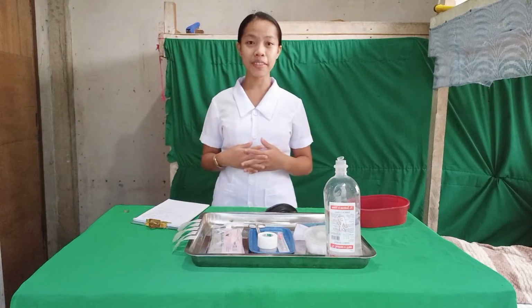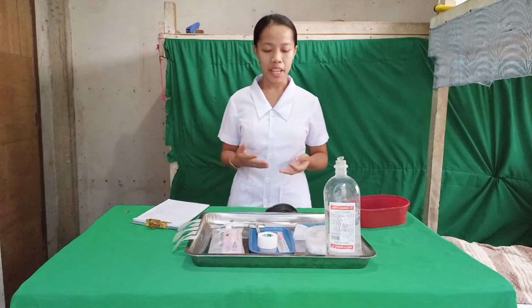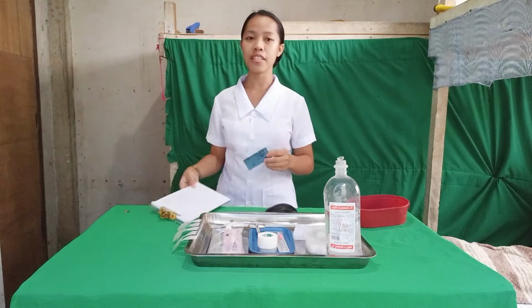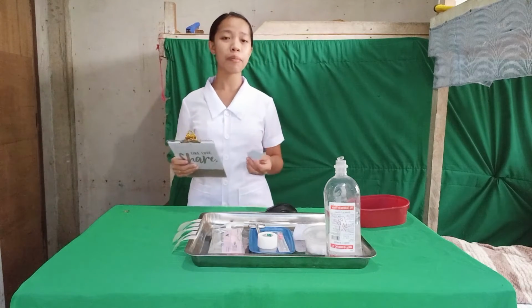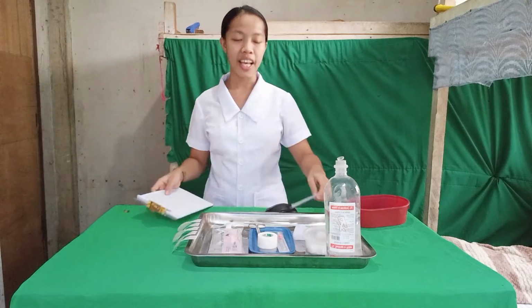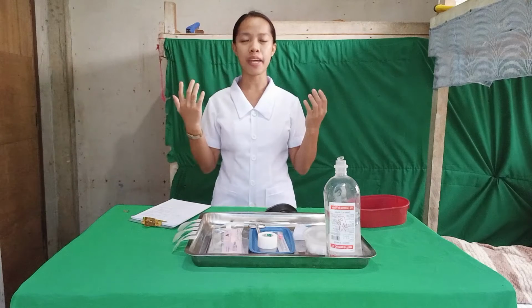The first thing we need to do is to check the IV solution and the medication additives with the physician's order. To do that, we will compare with what is written in the medicine ticket and what is written in the medical order sheet. This is to ensure that the patient receives the correct IV solution and medication as ordered by the physician. Next, we will wash our hands to deter the spread of microorganisms. So let's assume that I already washed my hands.